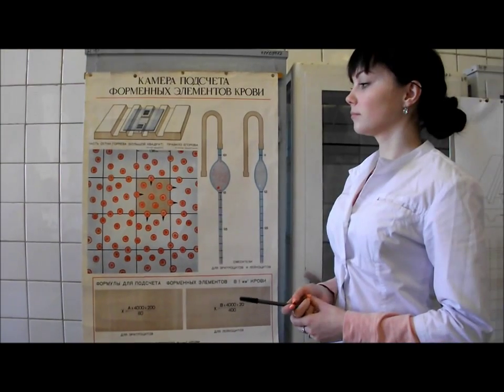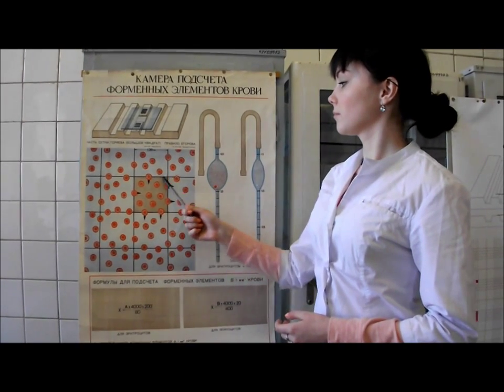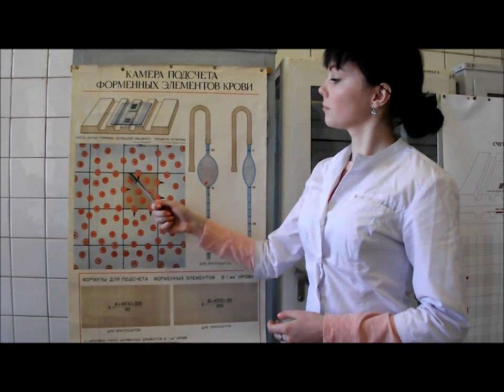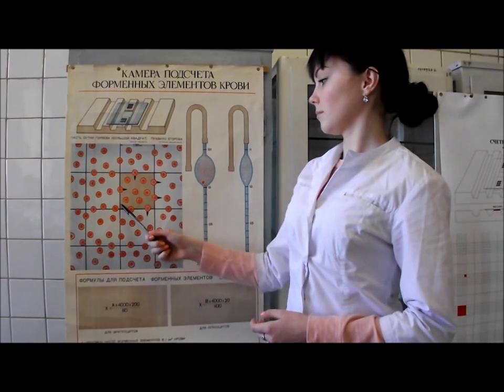For counting, use the rule of Yegorov. Only the cells lying inside the square and on the left and upper borders belong to this square. All other cells do not.